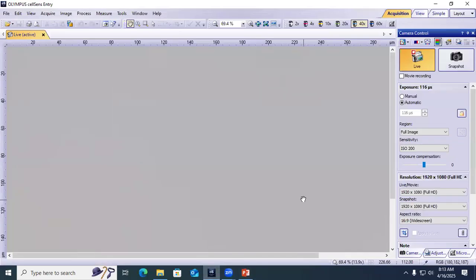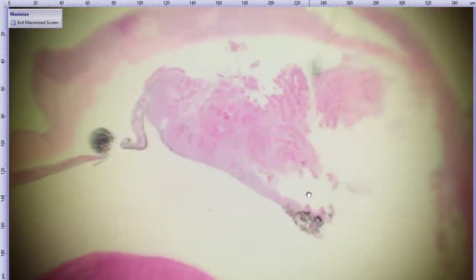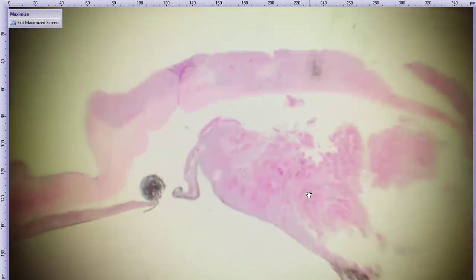Let's go to the histology. See if we can get a decent subgross going. Yeah, that one never works. We're going to do this one. So what? We have a lens. We do. Yes, we do. There's a lens. Just like the carp.